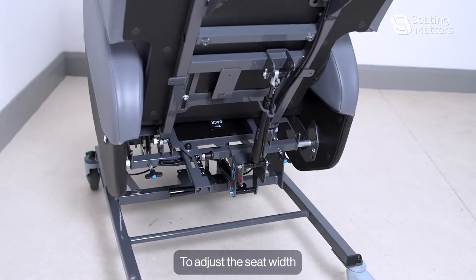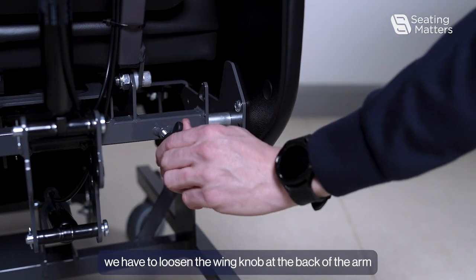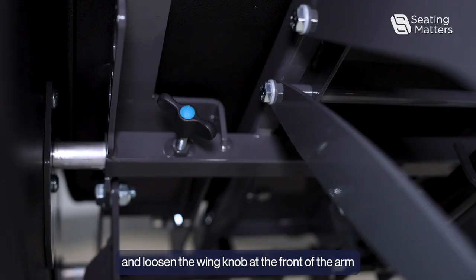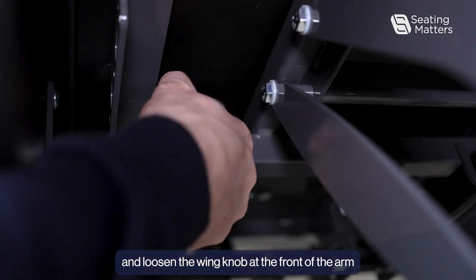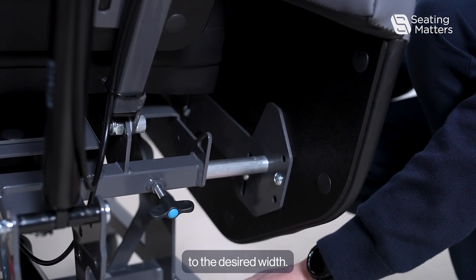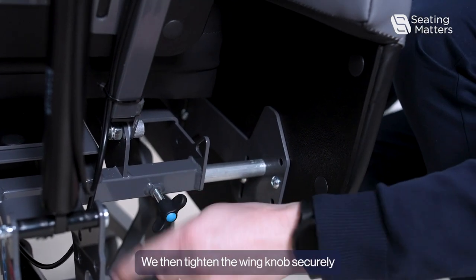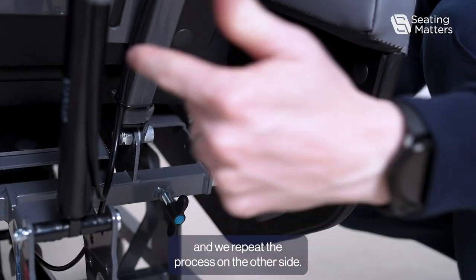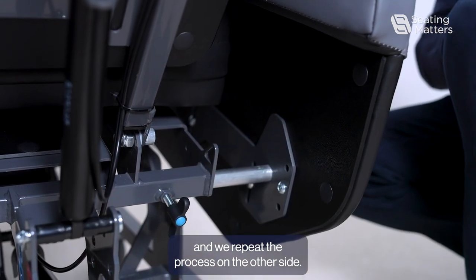To adjust the seat width, loosen the wing knob at the back of the arm and loosen the wing knob at the front of the arm. That allows us to move the arm in and out to the desired width. We then tighten the wing knob securely and repeat the process on the other side.